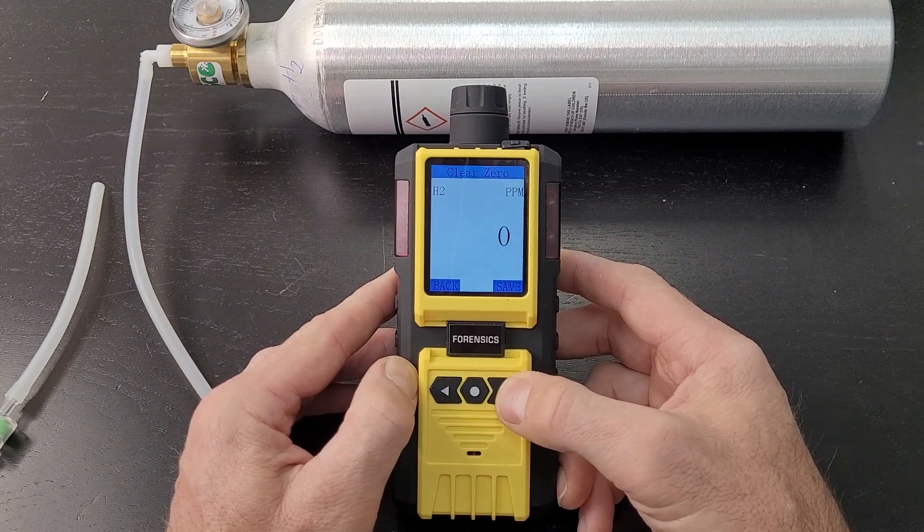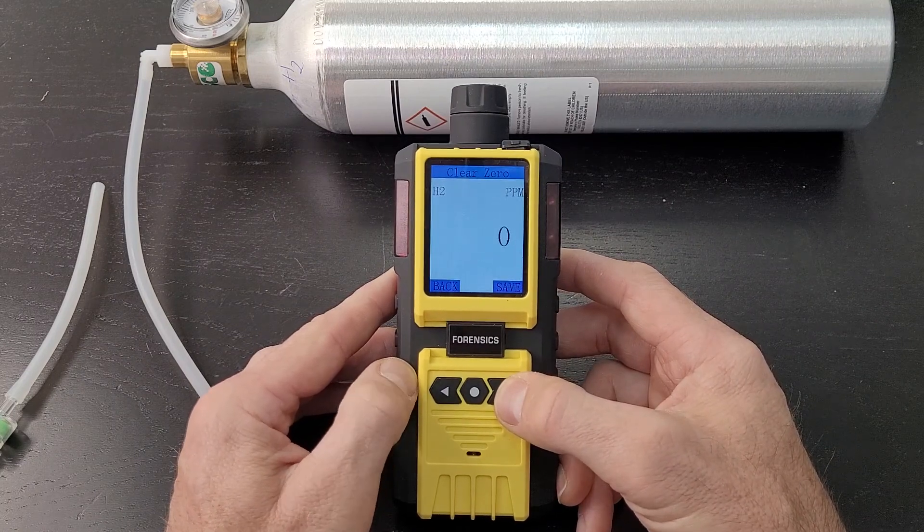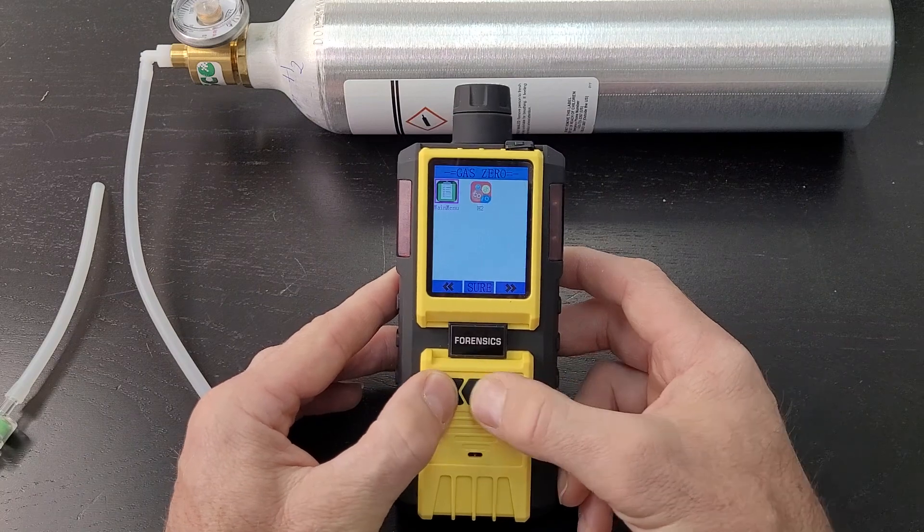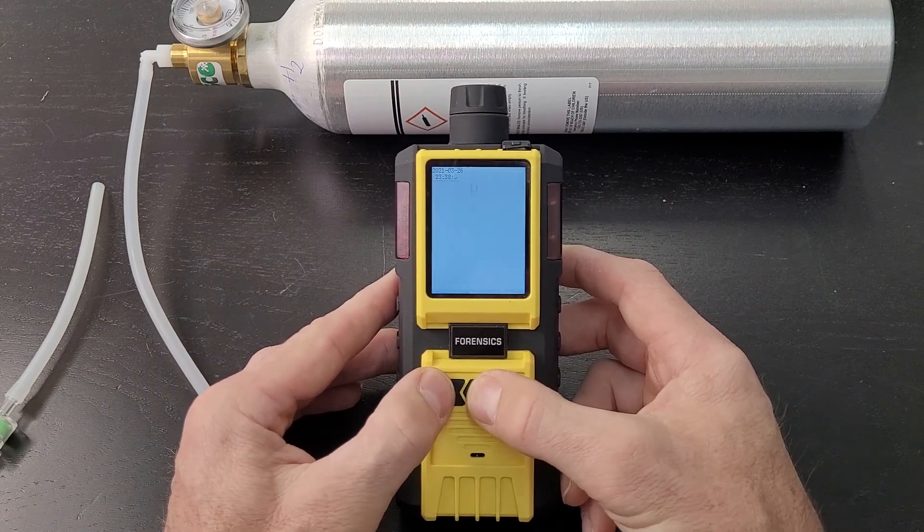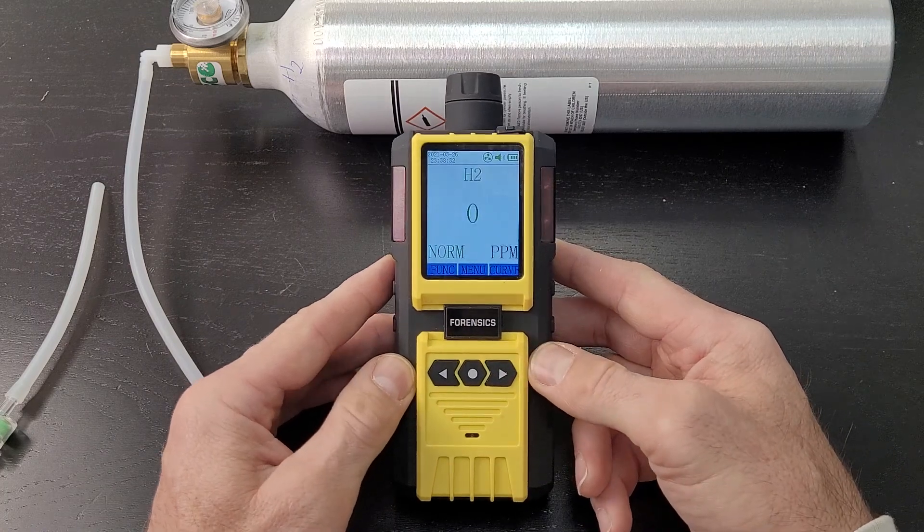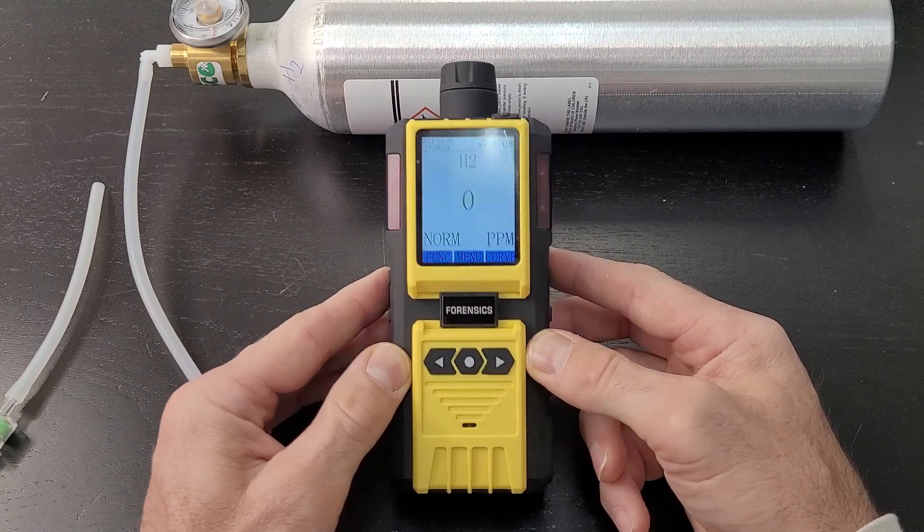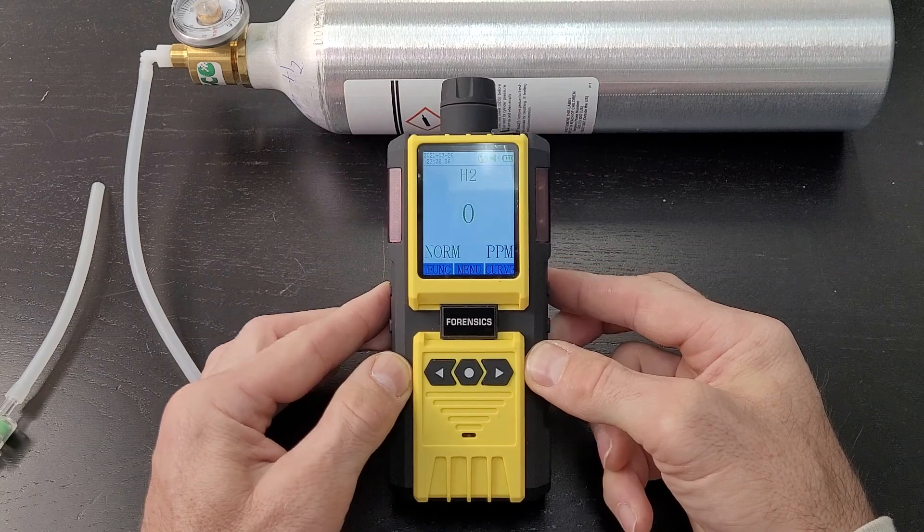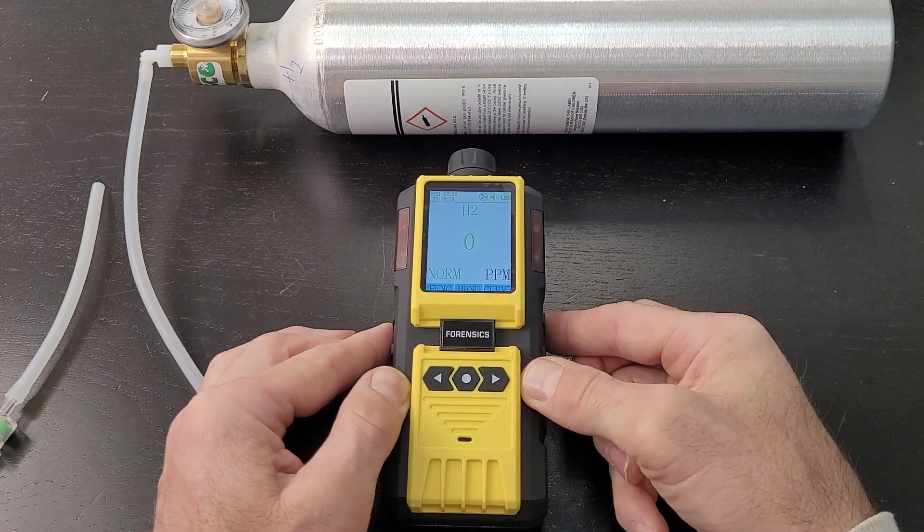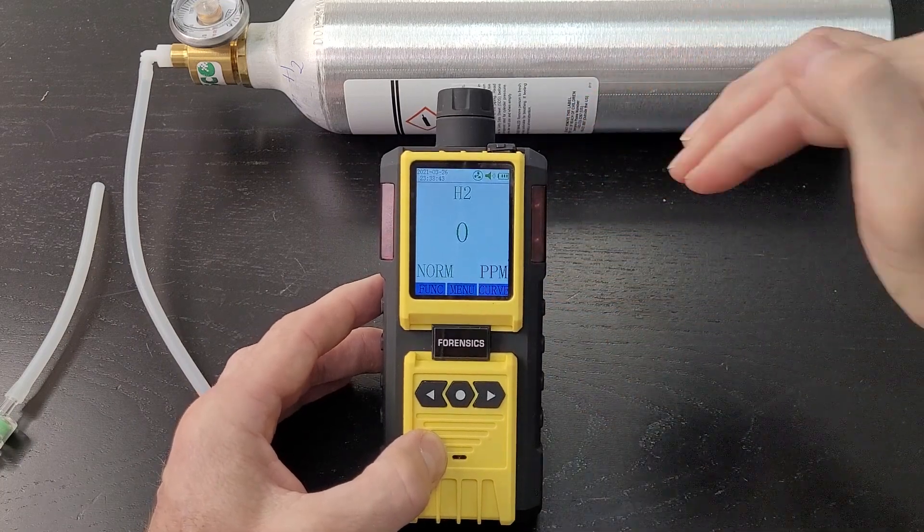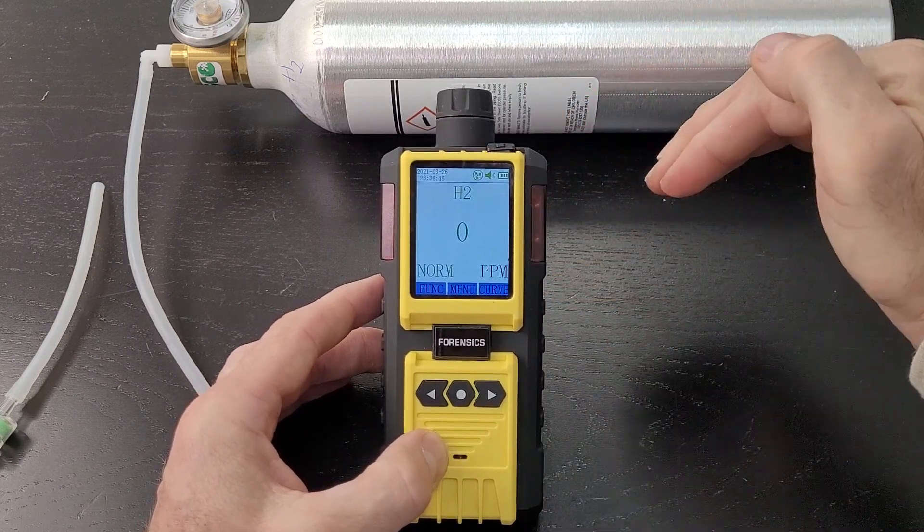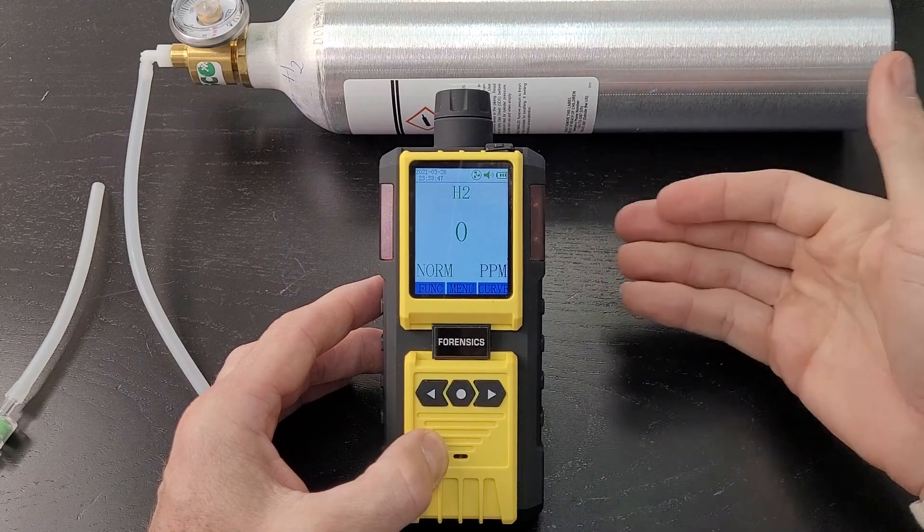Once you're done, go back to the main menu. Congratulations, the first step has been completed. Zero cal on these guys is very easy. Next we need to do a span calibration. We need to let the detector know 100 ppm is 100 ppm, and you need to do that periodically.